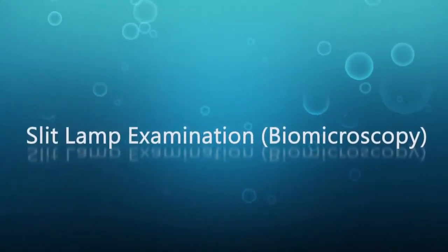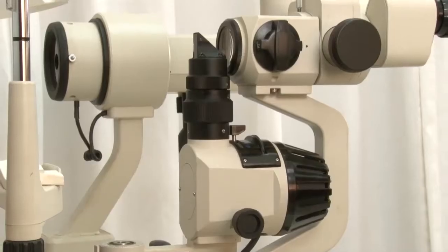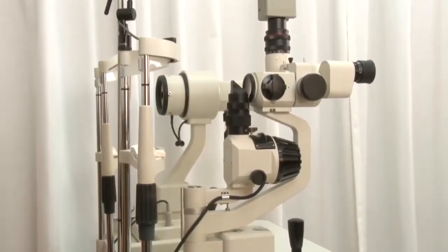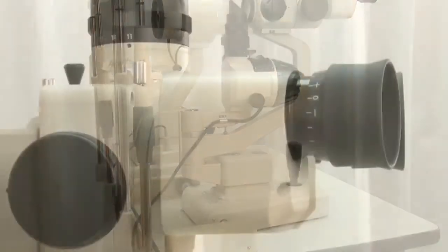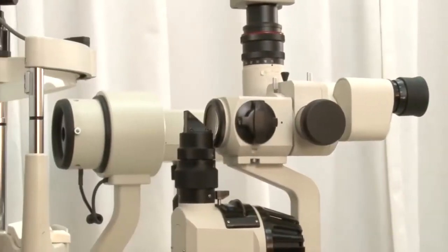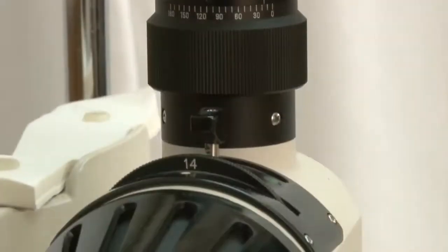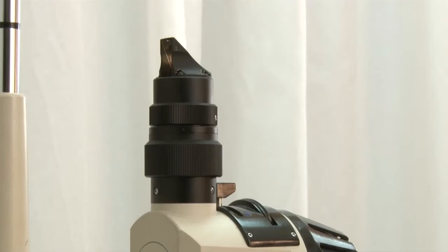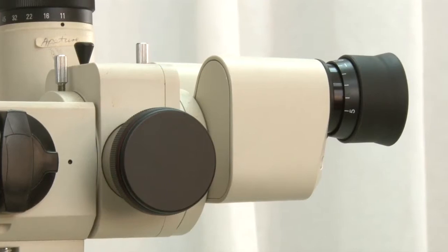Slit lamp examination, biomicroscopy. The slit lamp, also known as the biomicroscope, is a product of optical, engineering and electronic technology. Its wide magnification range, variable illumination system and unlimited angle of view make it indispensable for viewing ocular tissues and performing diagnostic and treatment procedures, including corneal evaluation, crystalline lens observation, gonioscopy, tonometry, laser procedure, fundoscopy, and contact lens evaluation.